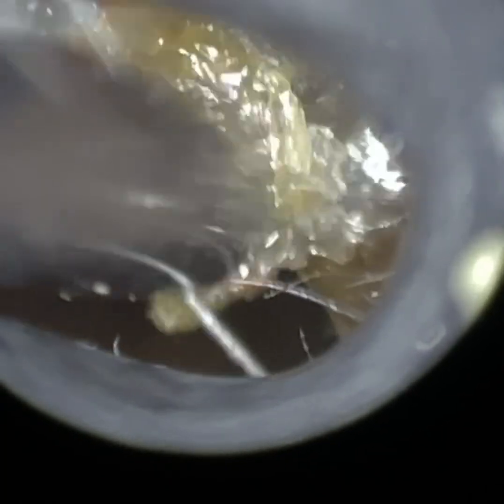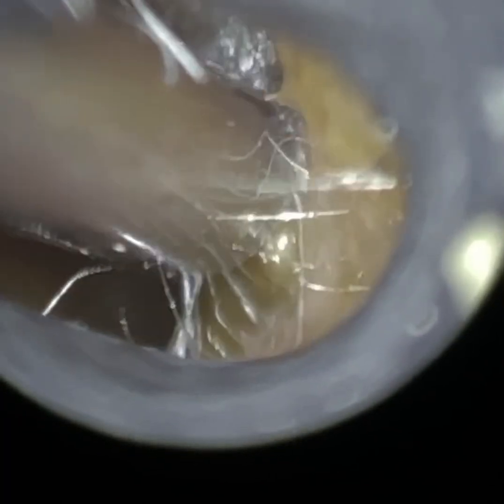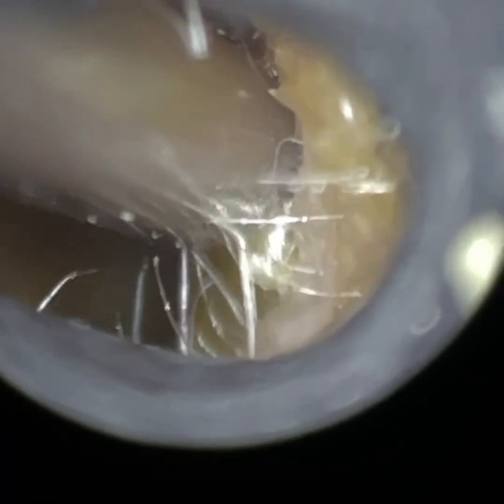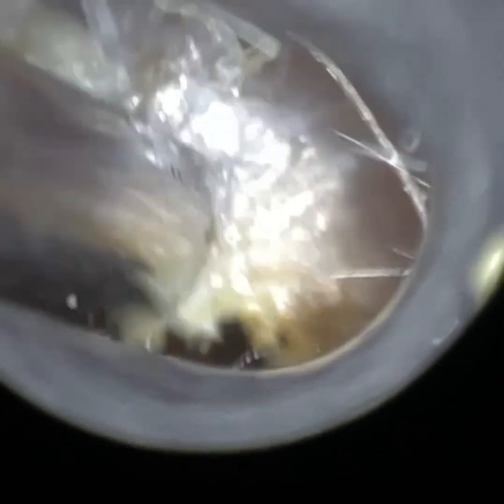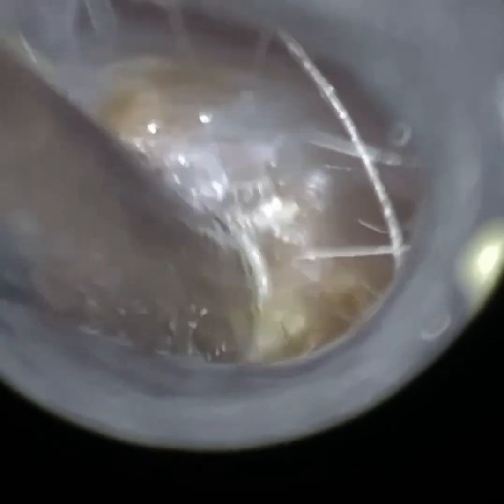I've got an ENT microscope and the magnification is fantastic. I was speaking to prominent ENT consultant Chris Colson and another ENT colleague Darius Rajalian, and they all agree that training people on a microscope with binocular vision is a difficult thing. They've noticed this during their careers when training registrars and ENT nurses — some just really, really struggle, because you're having to incorporate binocular vision and look through two eyepieces.